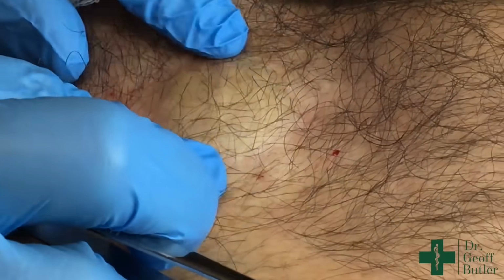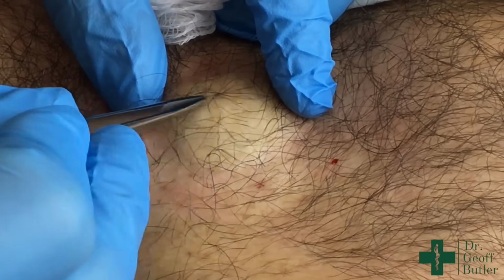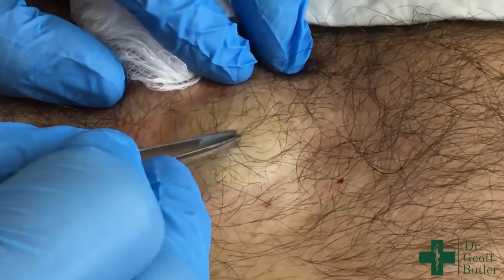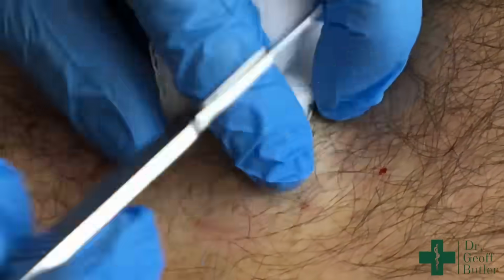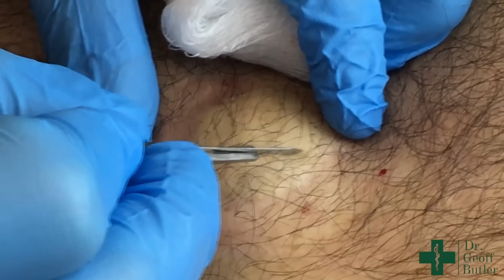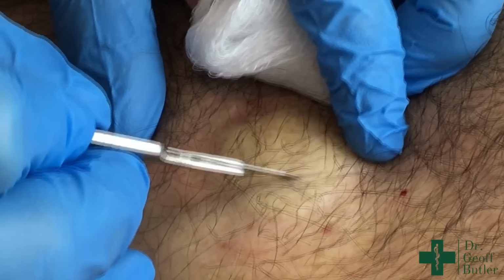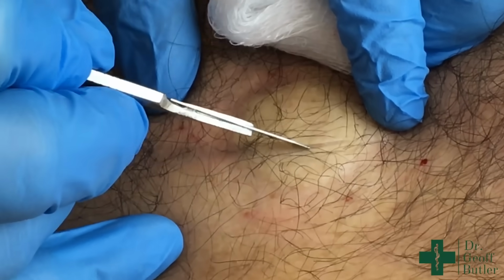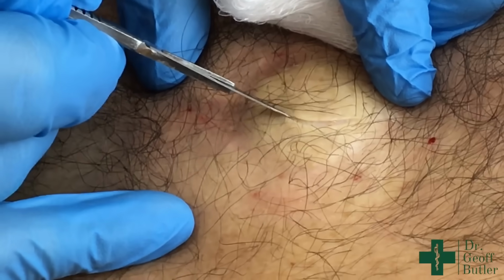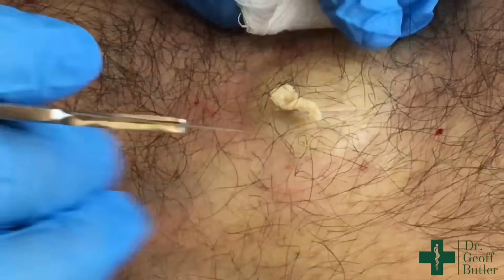Especially because of the size of it, we're going to just do an elliptical incision so we can work with that a little bit more, and then we'll seal that back up afterwards. So again, can't feel any of that? No. So this is certainly another case where I definitely go slowly. As you can see, even there, it's that close to the surface that it's draining already.